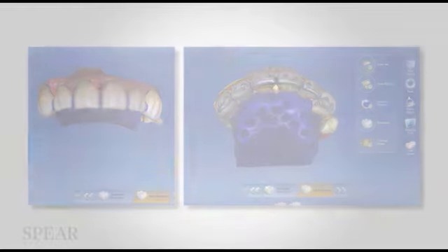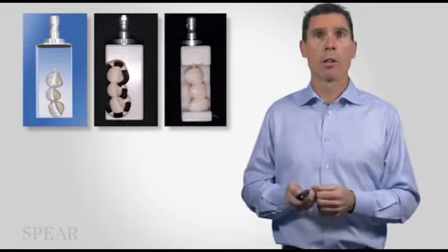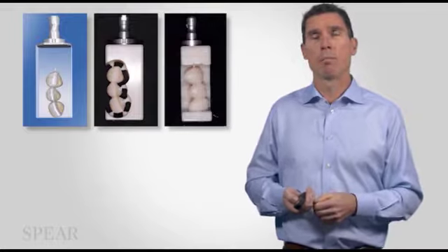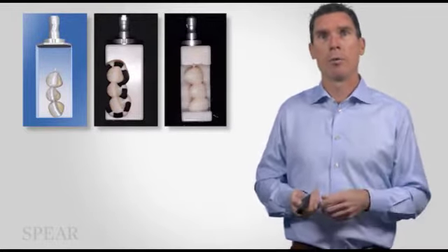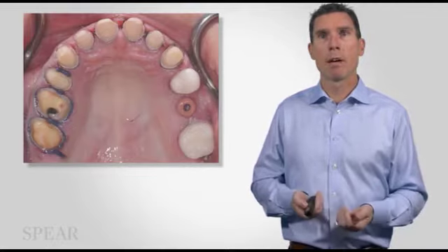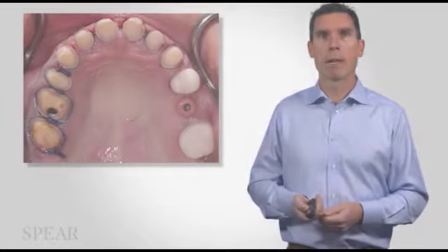But regardless, what I did is I now verified the proposal and stitched together that all those data points were good, and I milled provisionals. And I milled them in 2 sets of 3 again. So this is milled TelioCAD, and so I did 2 sets of 3. And while those were milling, I could actually come up and I could cut off and prepare the upper right. So the top ones were milling, I could cut and prepare the top right.